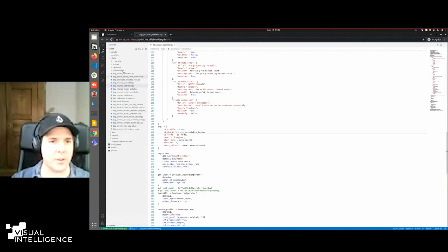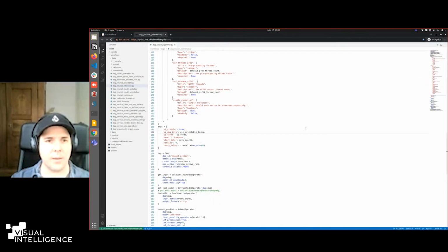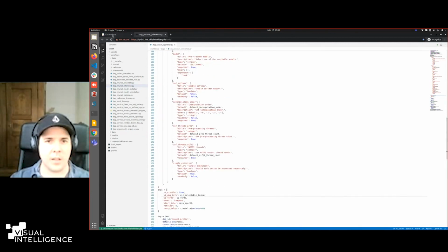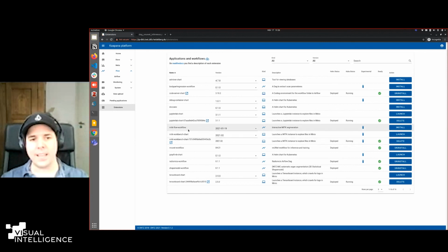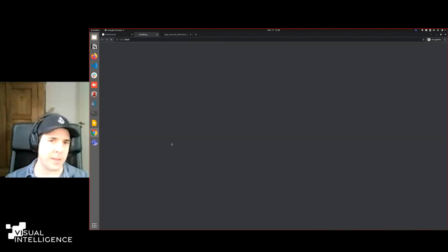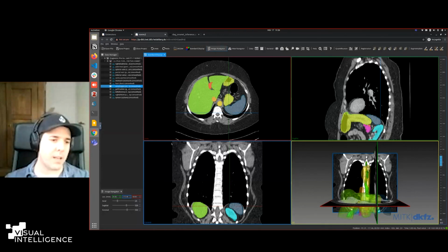You can make adjustments. What you see here, for example, is all these pipelines which are installed right now, listed in these Python files, and you can just make adjustments or change things. Another thing is, for example, JupyterLab, which is also available, or what I talked about before, MITK, which is usually a desktop application, but we also made some experiments with packaging this desktop application inside streaming environments. What we do is we run these desktop applications in containers and then stream the application in the browser. That's how we try to make desktop applications also run inside this cloud environment.